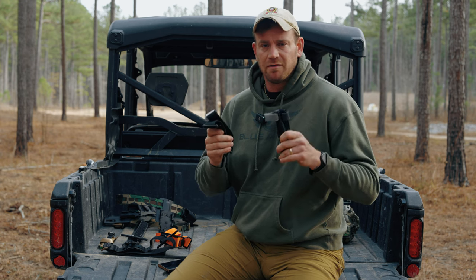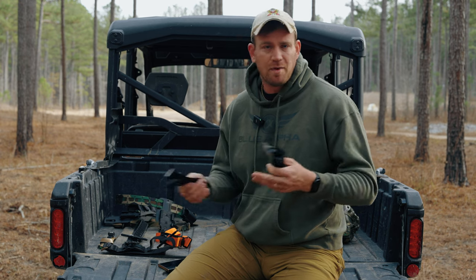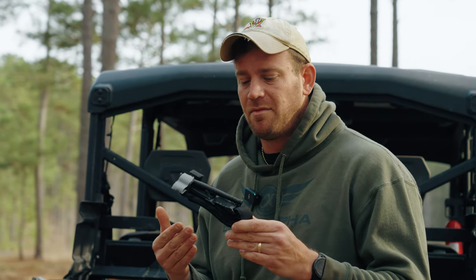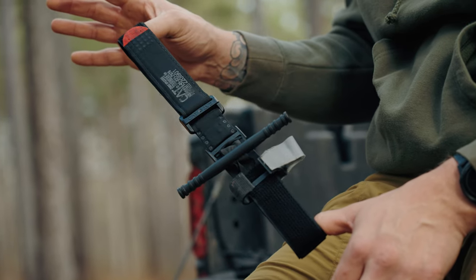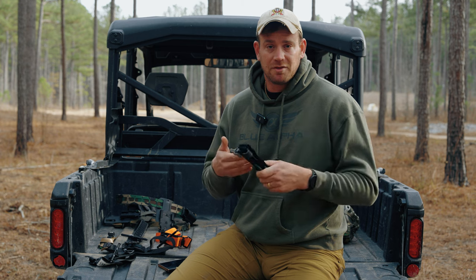So what tourniquet's the best? Today we're going to go over two of the most popular tourniquets and then also a couple options that you probably haven't heard of that may be a better fit for you. Starting off is the CAT Tourniquet — this is the Gen 7. It's probably the most common tourniquet you'll see out there, just from its use in the U.S. military. It's a very robust, very simple tourniquet to use, and that's why we built our Blue Alpha Tourniquet holder around it.